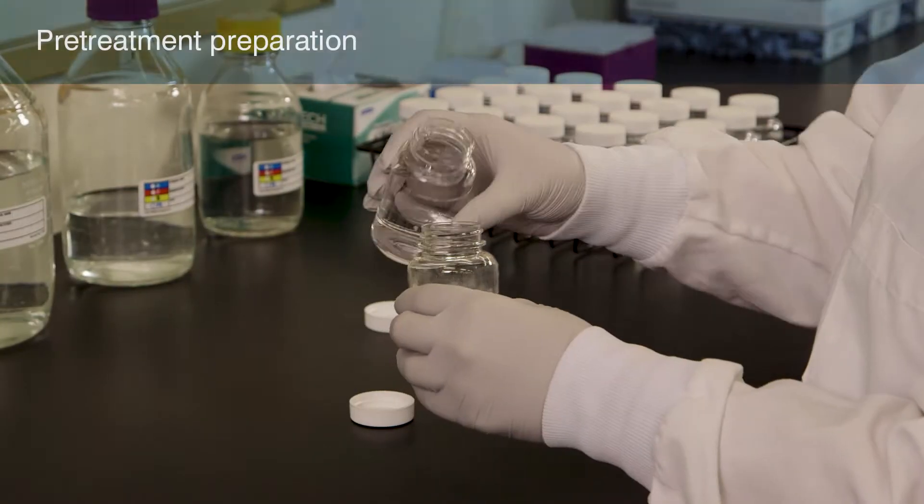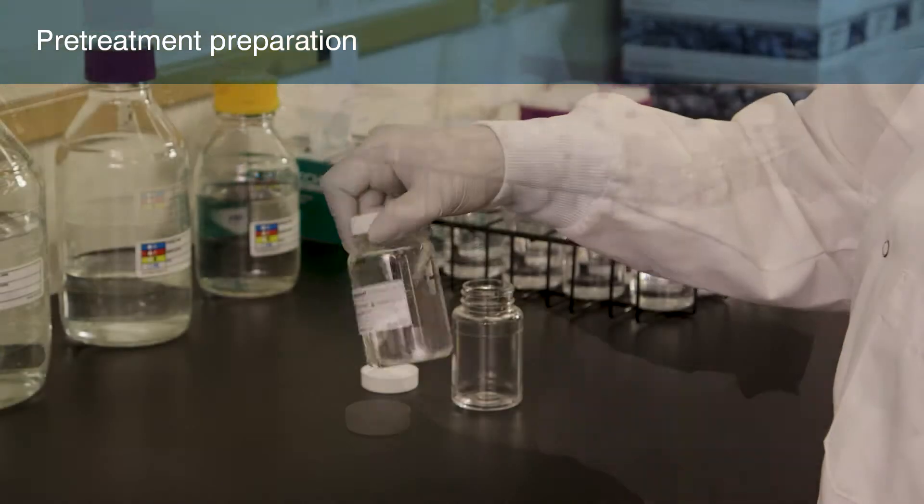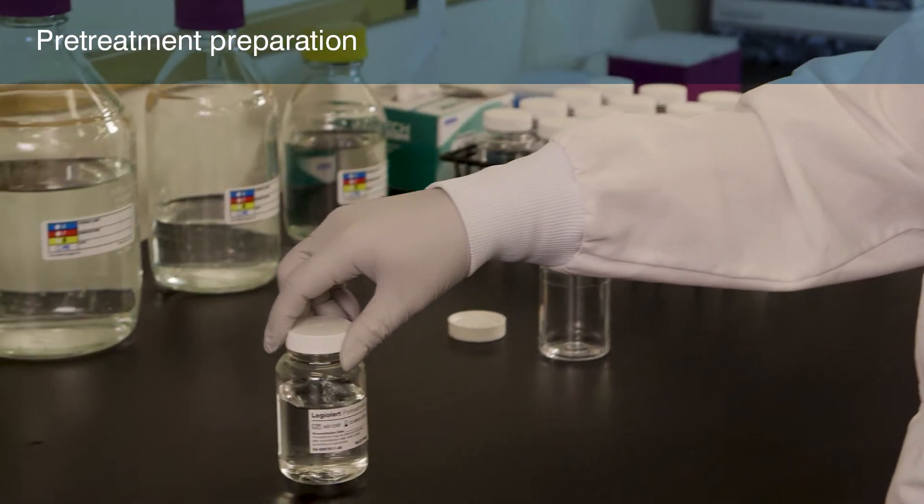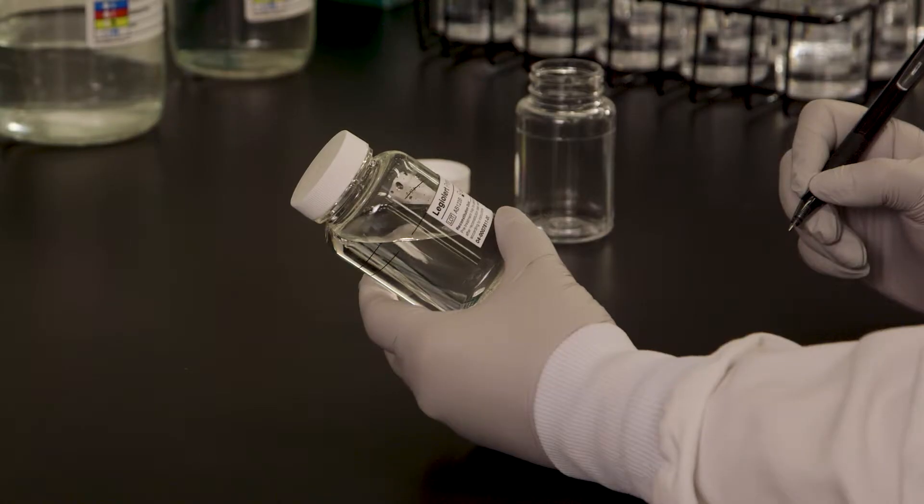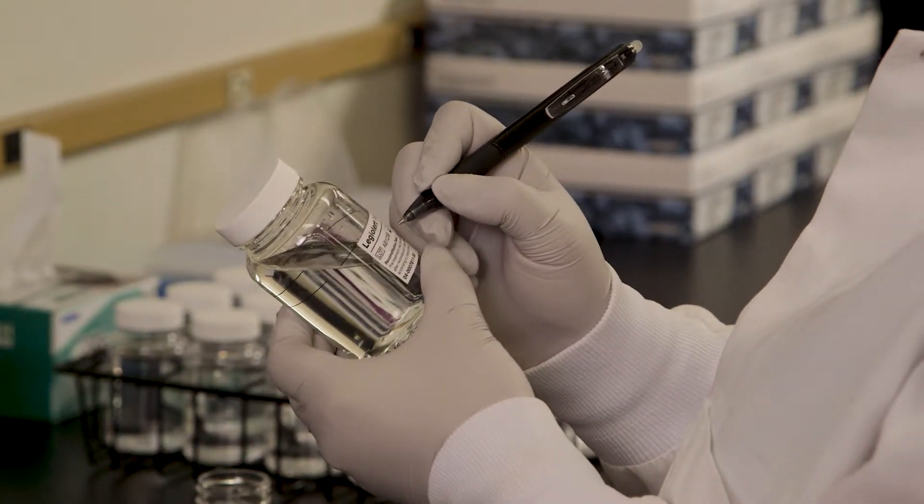Reconstitute the Legiolert pretreatment by adding 100 mL of sterile DI water to the vessel and then shake until fully dissolved. Mark the preparation date on the bottle. Refer to the Legiolert pretreatment product insert for more information.